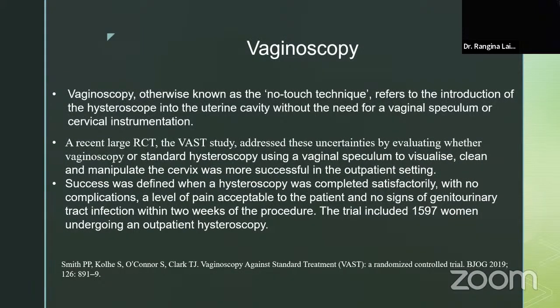I have spoken about vaginoscopy. My mind opened up when I started hysteroscopy. I was really not sure whether it is about the uterine cavity, or the cervix, or the vaginoscopy. But there are lots of studies which say that, yes, it can be used as a no-touch technique, which I shared at the beginning of the talk.